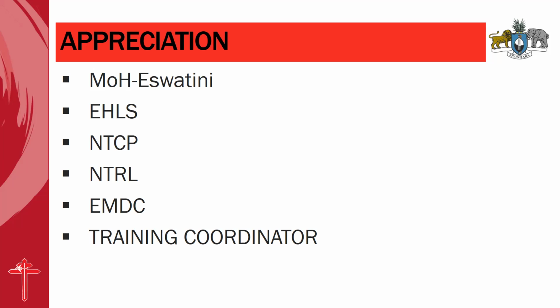And also GeneXpert, because these patients are already waiting at the facility, just waiting for the results. So we are saying 2.5 hours for GeneXpert. If you include the XDR assay, it should go to around 4 or 5 hours. Microscopy, let it not pass 24 hours. That will be serving the patient. So that is our recommendation. Thank you very much. All right.